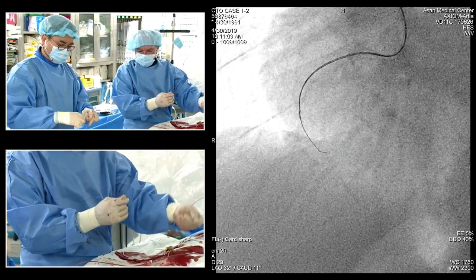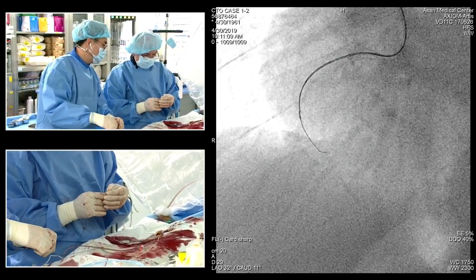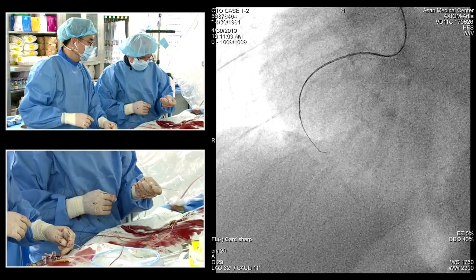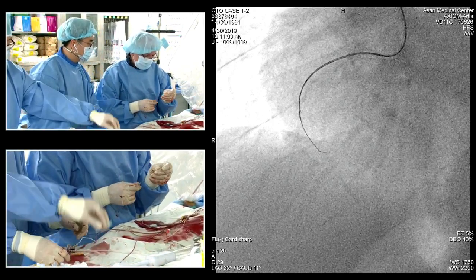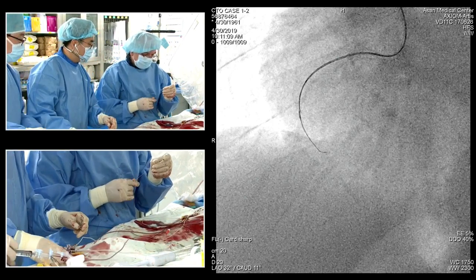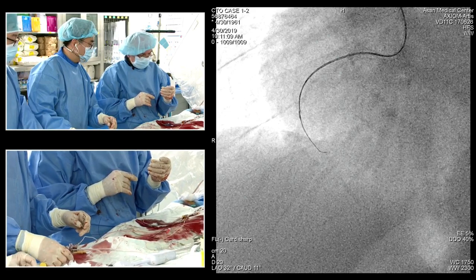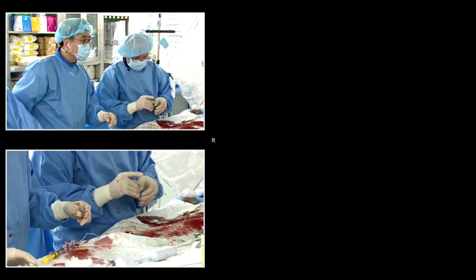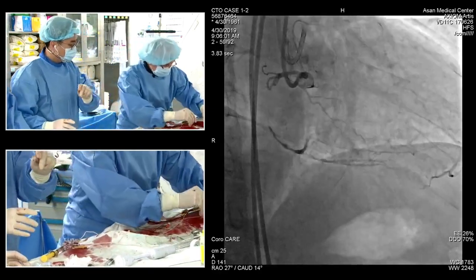So therefore, I think once you decide probably for ADR, probably even a little bit before the parallel, where the first Gaia was in a great position, there, if he wanted to, he could probably use the ADR, the Stingray balloon for the re-entry. But it was such a nice position where you had a great chance also for the parallel. But it's not always so easy as we think, yeah? So I think the retrograde would be good.